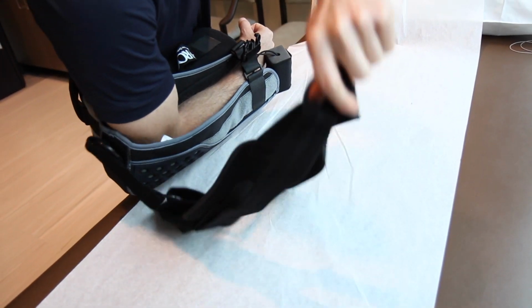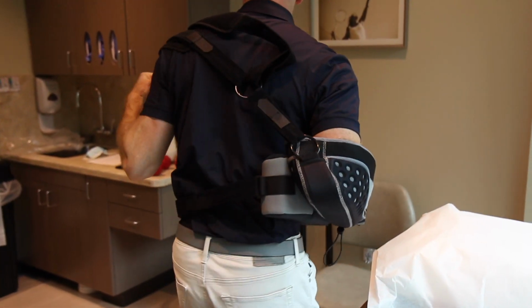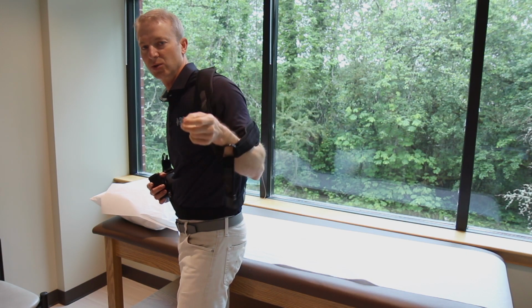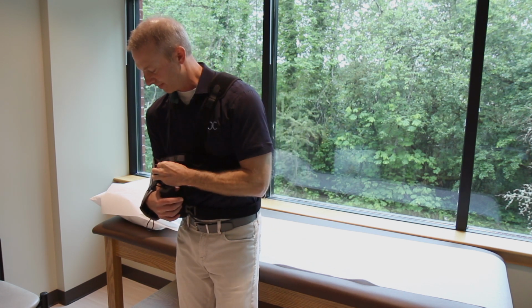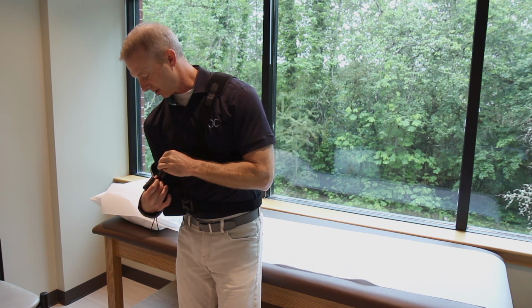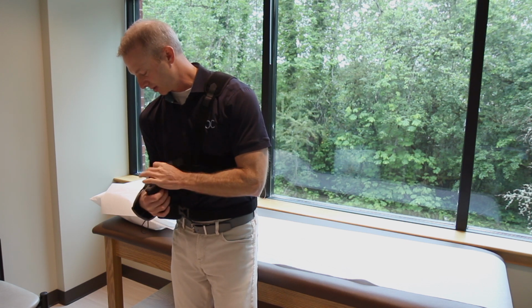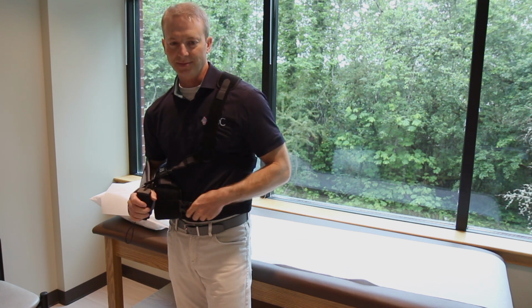And then reach over. Bring the strap over your shoulder, and then slide your hand up through the two straps, and then bring the buckle over and reconnect the buckle like that.